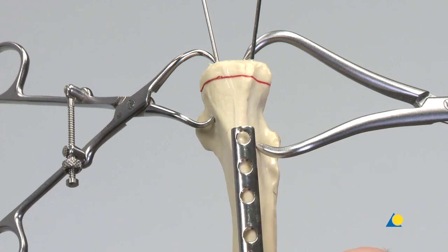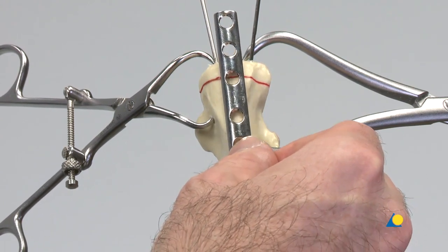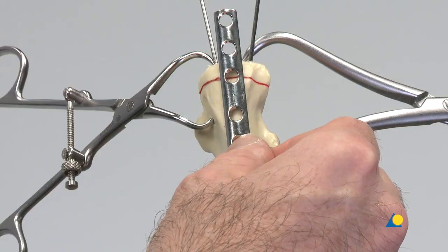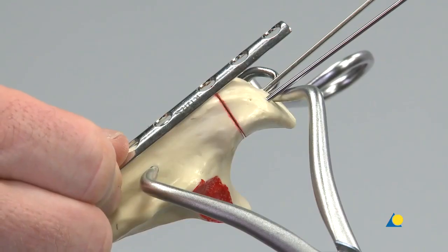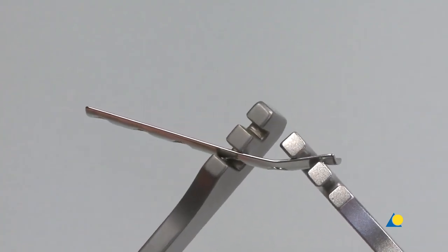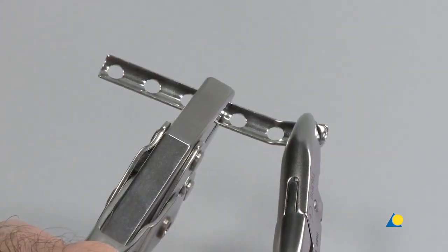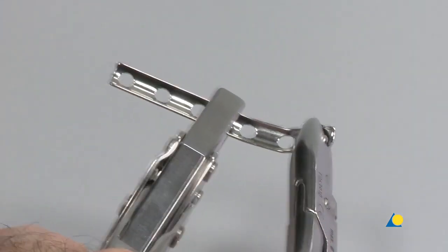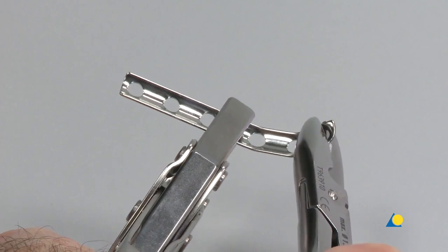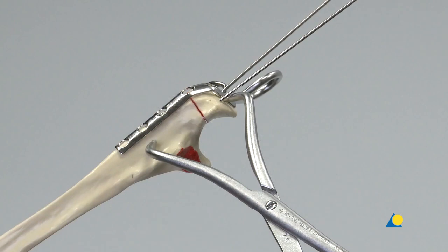The 1/3 tubular plate must be contoured to fit the proximal ulna. It must be bent around the tip of the Olecranon, through the split of the triceps tendon, and lie as close to the bone as possible. The plate is contoured with 2 bending irons. It may be easier to use the flat-nosed parallel pliers and the wire-bending pliers. The plate should usually be bent to 90 degrees. The contoured plate is positioned on the bone.